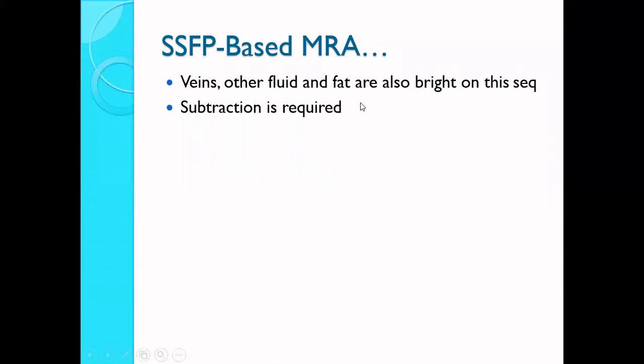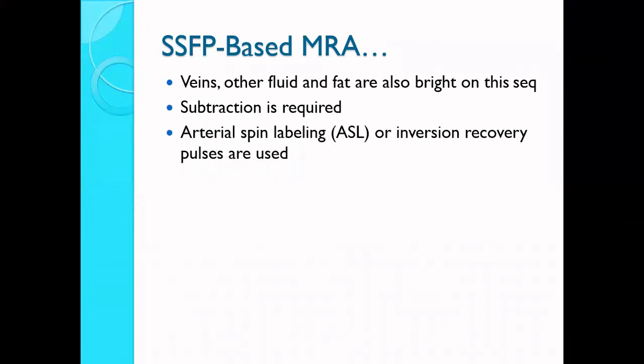We always do subtraction when we take a mask image in which the contrast of that area is different from that of the one you are achieving. When you subtract both of them, the resultant image you have, you call it the subtraction image, and that's how subtraction is required in this particular imaging technique as well. In the previous lecture we studied subtraction in great detail, like how subtraction happens in the arterial and the venous system.